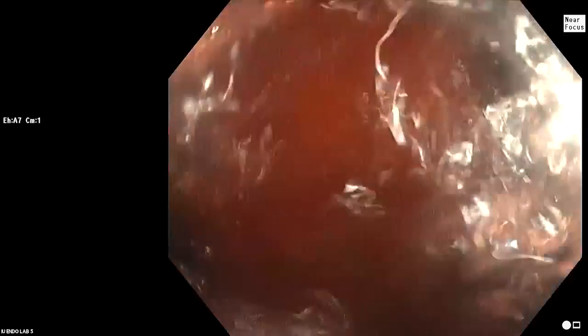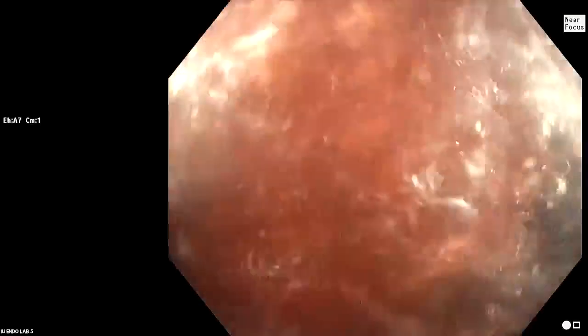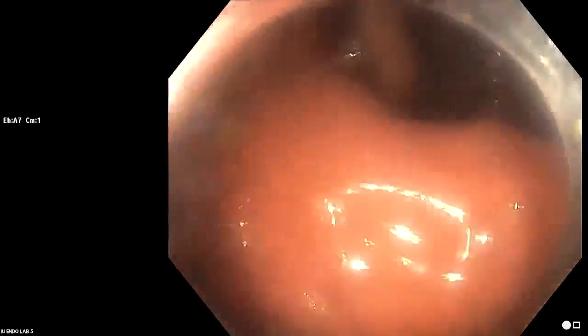I wish I had another serrated. A lot of these patients with SPS, when they come, they'll have multiple big serrated lesions. In our referral practice, 30% of the time when the referred lesion is an SSL, we diagnose SPS based on the number of additional polyps, lesions that we see during the procedure. And so just as we were in the first case, we were debulking the rectum of an FAP patient with cold resection.